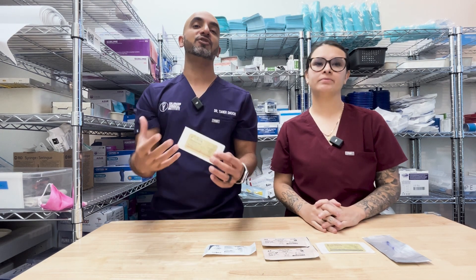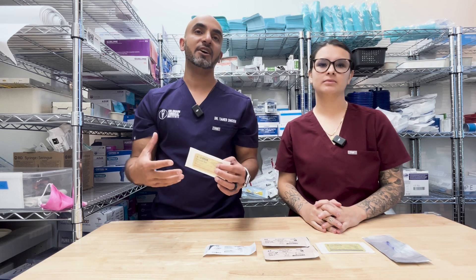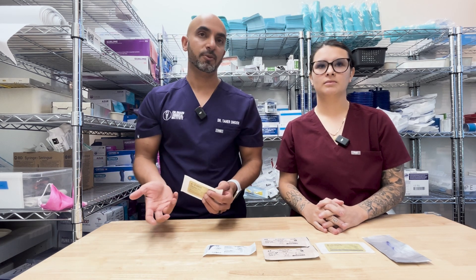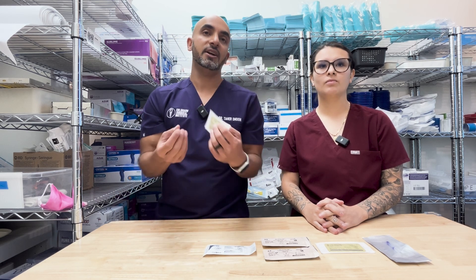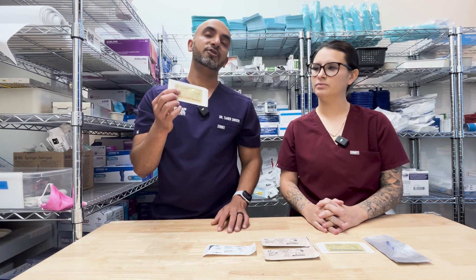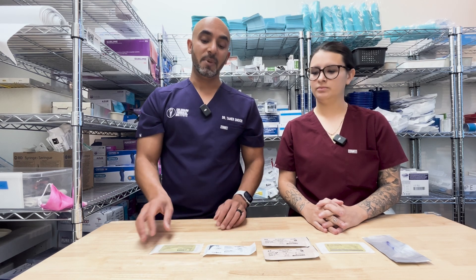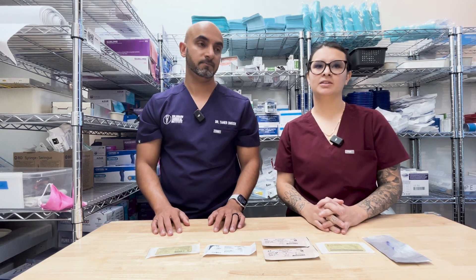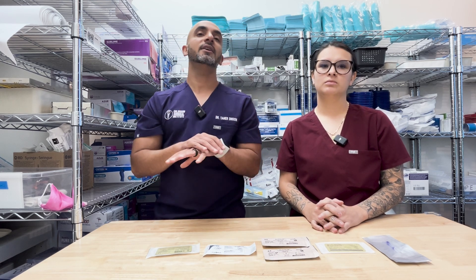Now we're going to talk about how much to use. Every once in a while you make a mistake and need extra, but ideally we want you to focus on using as much as you would in private practice — be conscientious of overhead and how you run your business. From an educational perspective, if you've got to use more to get the knowledge and tactile sensation, that's fine. But ideally for a wisdom tooth case, you should be able to use one pack of chromic. Quite frankly, I barely suture my wisdom teeth anymore. A lot of that comes down to case selection and flap design — if you can get conservative with your flap design, you're not going to need to suture your cases.